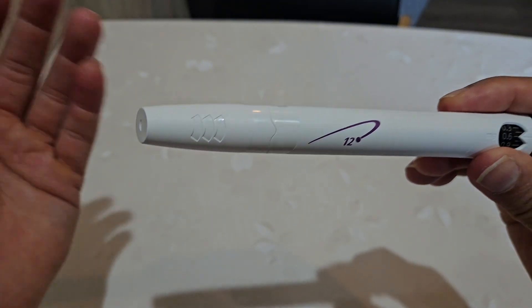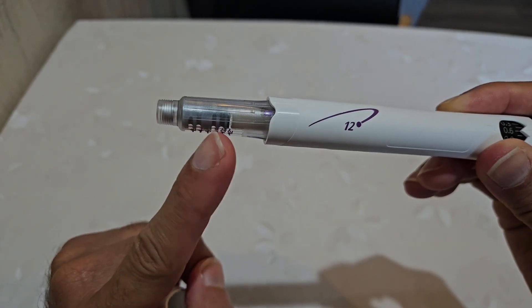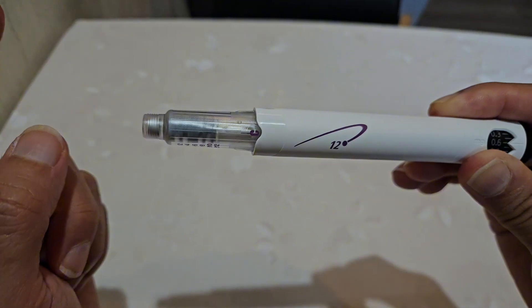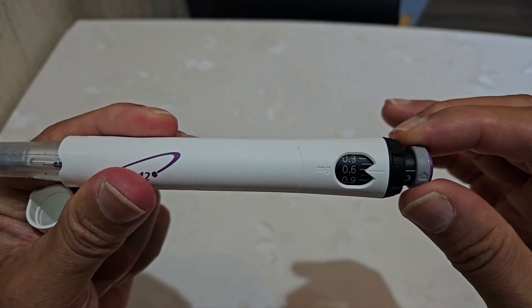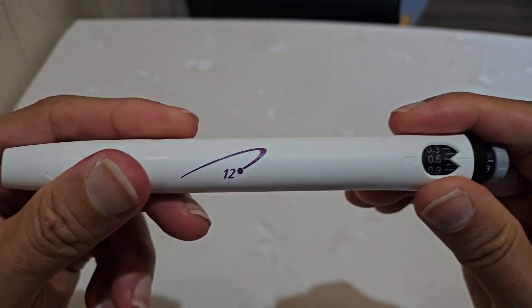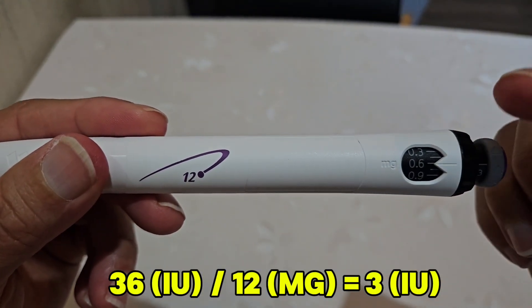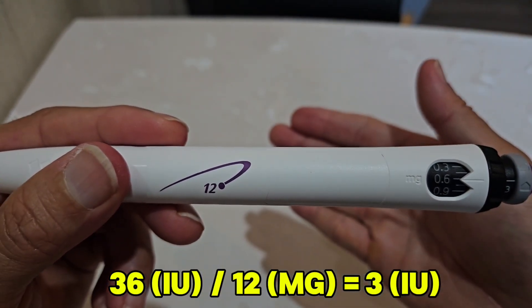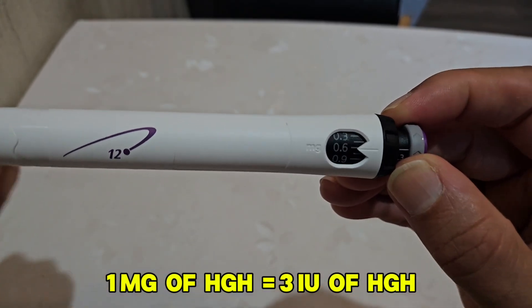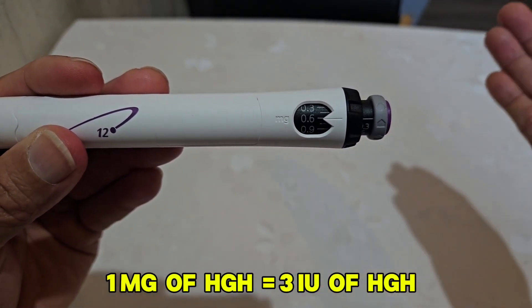This pen has already been reconstituted and completely used. If I open it up, you can see the two chambers — there used to be liquid here, which is now gone, and here you can see the leftover powder. There is no more liquid — if I attempt to click the injection button, nothing happens. Now, if I divide 36 by 12 — international units divided by milligrams — that equals 3, meaning every milligram of growth hormone equals 3 international units.